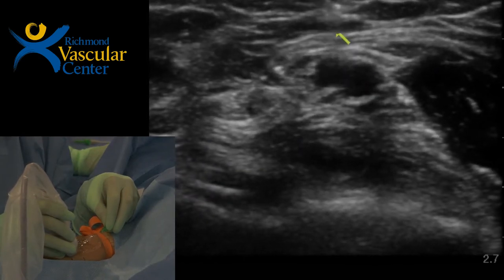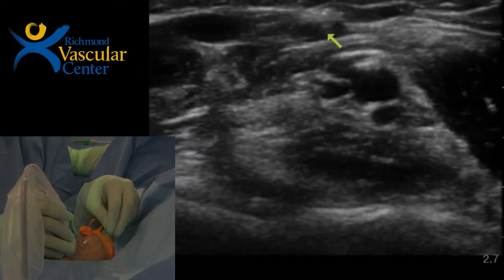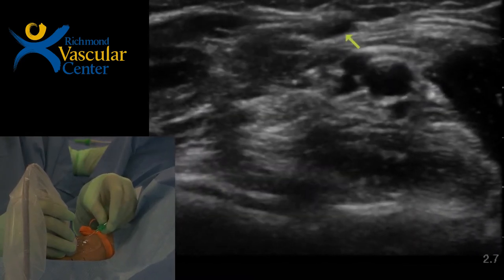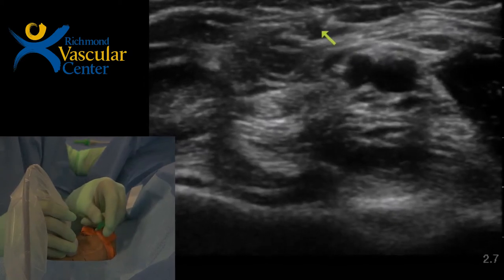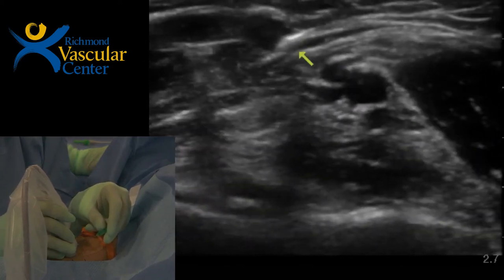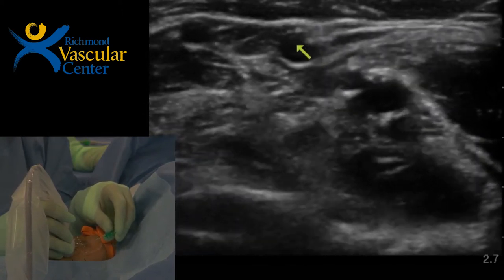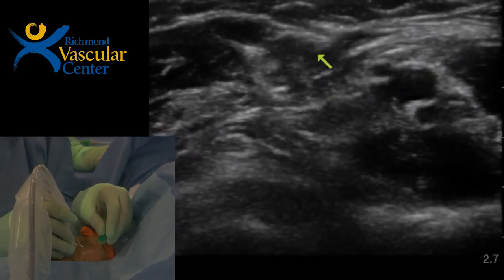So this switching back and forth between transverse and long is very useful. I'm still not in the vein yet. There we go. I'm already at the pop. Okay.